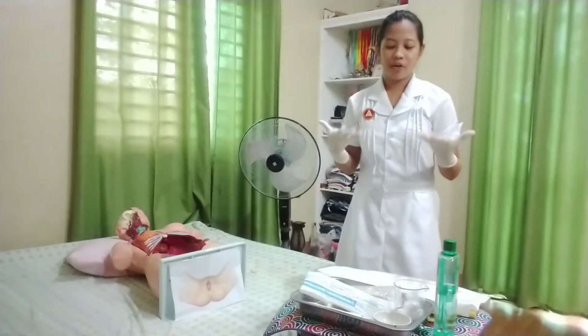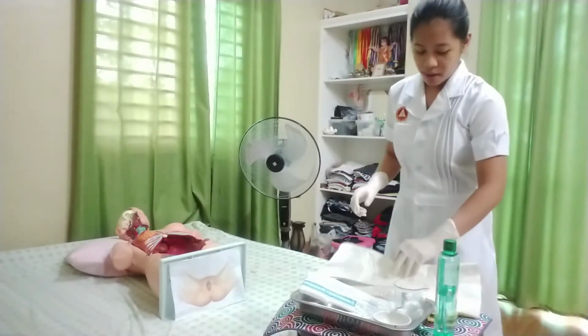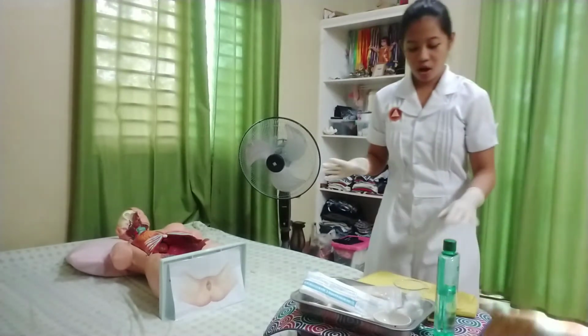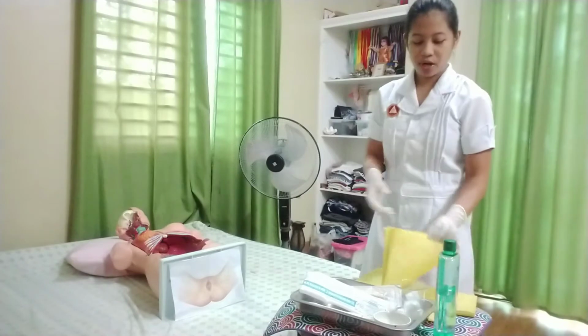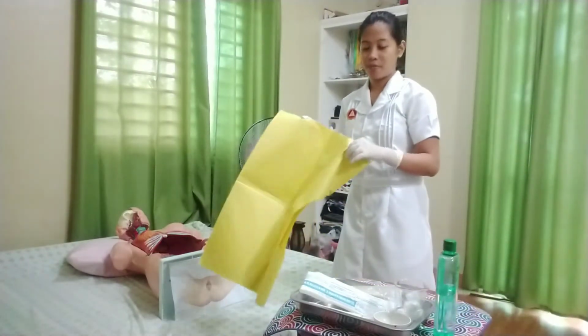Now that I have put on my sterile gloves, I will be removing the packaging, and I will place the sterile fenestrated drape over the genital and perineal area of my client, draping it above my client's thigh.